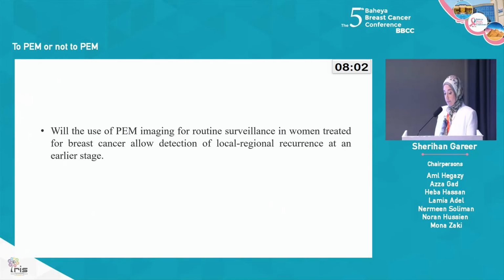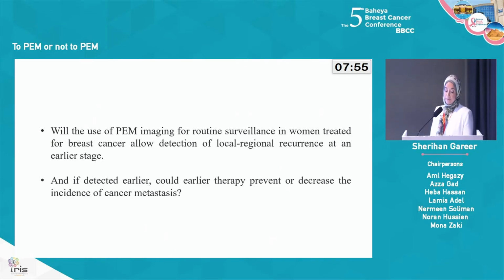Will the use of PEM imaging for routine surveillance in women treated for breast cancer allow detection of local regional recurrence at an earlier stage, and if detected earlier, could earlier therapy prevent or decrease the incidence of cancer metastasis? This is a question that should be answered.